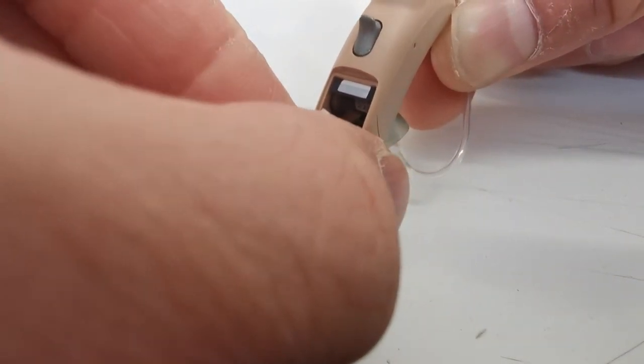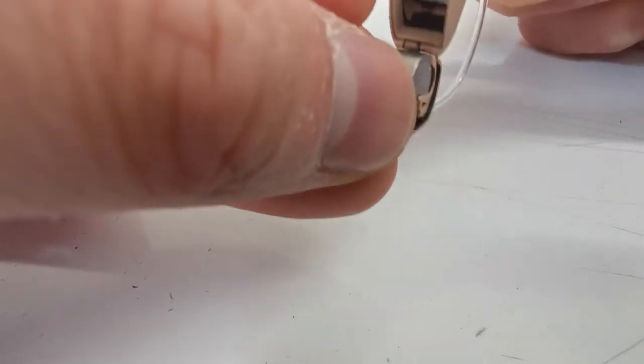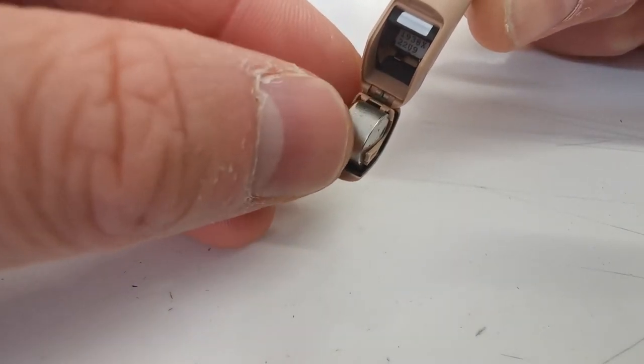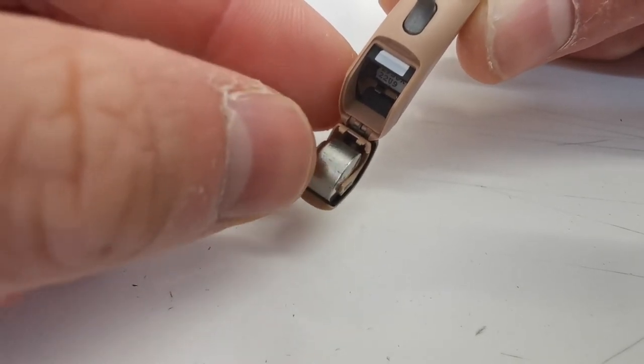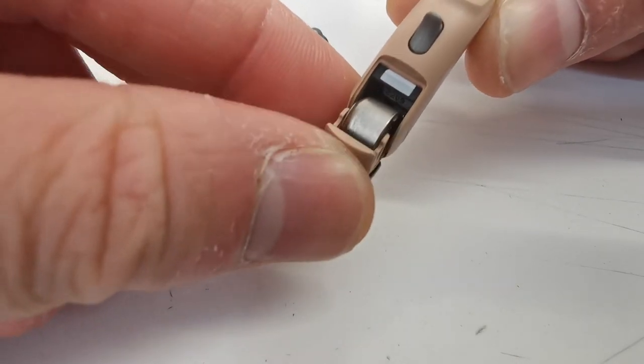If you have the battery the wrong way around, you'll find it doesn't sit in the battery drawer properly. Do not attempt to turn the hearing aid on with the battery the wrong way around as it can damage the hearing aid.